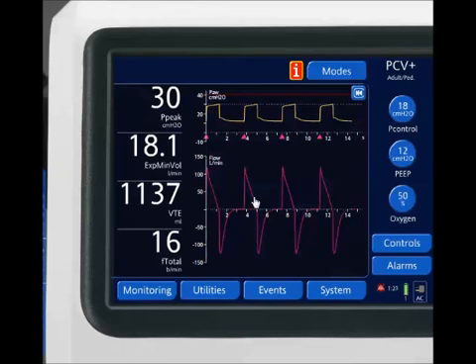So that's the benefit of pressure control. The patient gets all the flow they want. However, it's going to give them these much higher tidal volumes. So what one would usually do is decrease the pressure control, but they'll end up with flow asynchronies here also. So this is why volume control ventilation is used a lot in ARDS, because I could set a tidal volume and that would be my threshold. So I have these huge tidal volume variances right here.